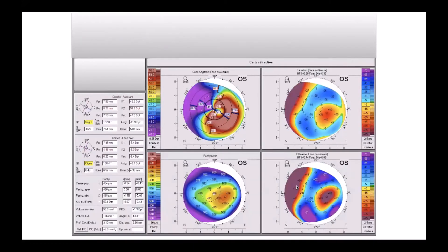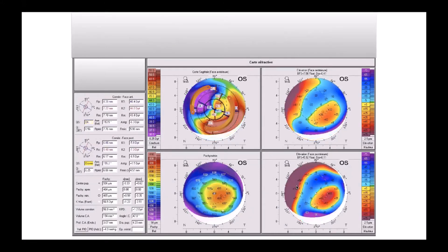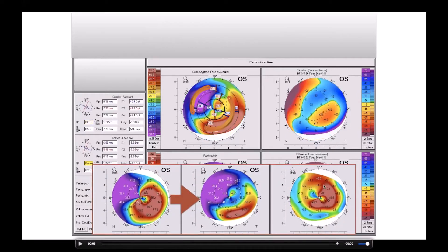This is another crescent form. For this case, I put two corneal rings with different shape, different length, and depth. Four months later the result shows something very different. As you see here, the differential map shows almost minus nine diopters of astigmatism correction.